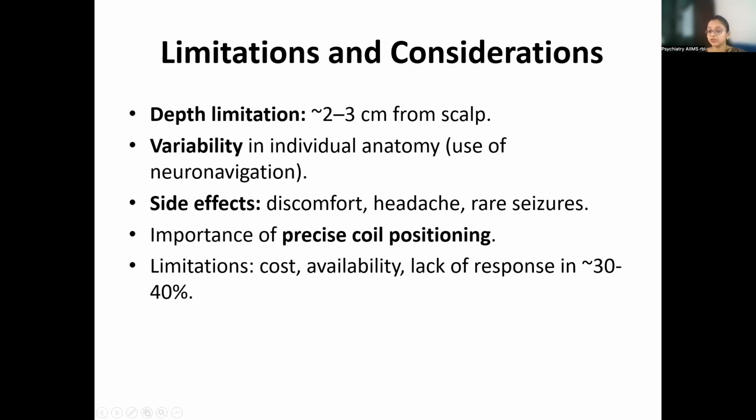The other limitations, of course, are the cost, the availability, and of course, the lack of response in 30 to 40% of patients. I think with developing technology and with more widespread use of rTMS in institutes, the cost factor we might be able to overcome, especially in government institutes where we are able to provide this therapy at a very minimal cost to our patients.